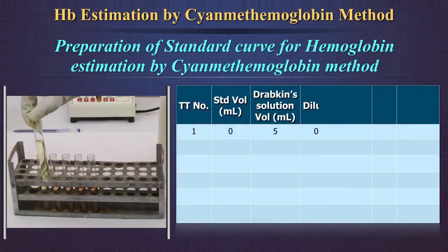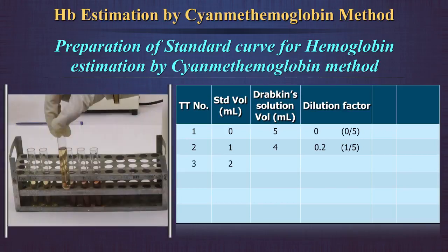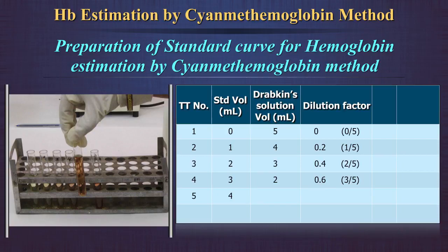In the first test tube, take 5 ml of Drabkin's solution. In the second test tube, mix 1 ml of standard with 4 ml of Drabkin's solution; the dilution factor is thus 1 in 5, or 0.2. In the third test tube, mix 2 ml of standard with 3 ml of Drabkin's solution; the dilution factor is 0.4. In the fourth test tube, mix 3 ml of standard with 2 ml of Drabkin's solution; the dilution factor is 0.6. In the fifth test tube, mix 4 ml of standard with 1 ml of Drabkin's solution; the dilution factor is 0.8.